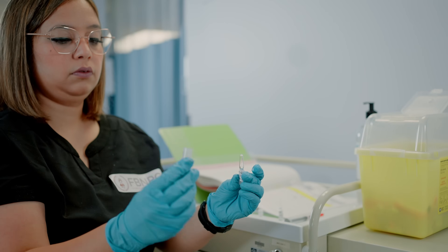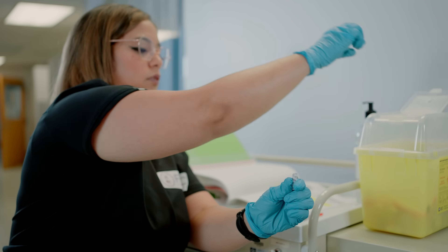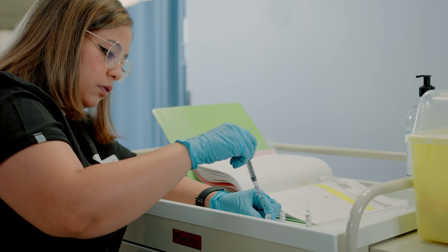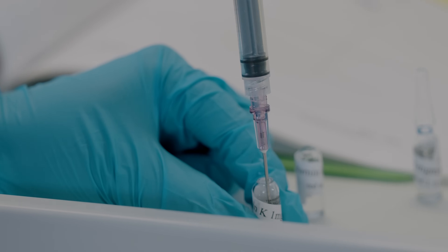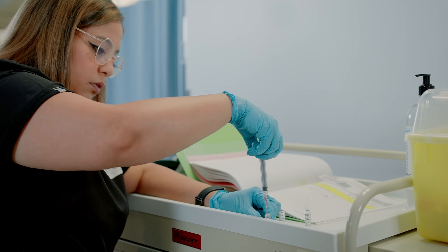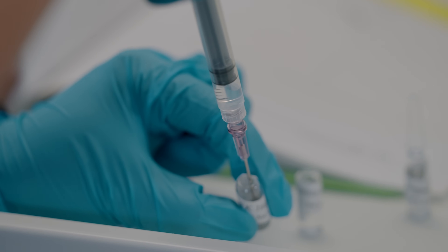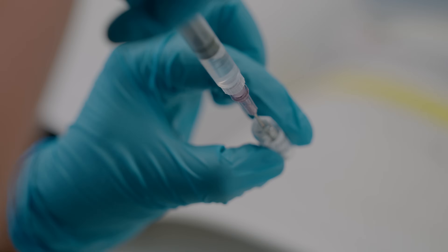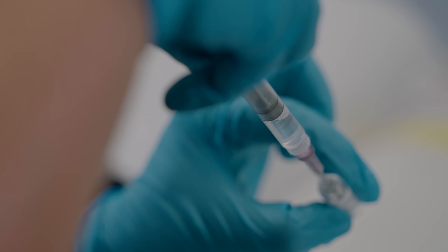Once you have snapped the top of the ampoule, carefully take the glass piece that has come off and set it aside or place it directly into the sharps container. Now grab your syringe with the filtered needle and insert it into the ampoule to withdraw the correct amount of liquid. You may need to slightly tilt the ampoule to reach the liquid if your needle is not long enough — make sure the needle is touching the bottom so you can draw the complete dose.